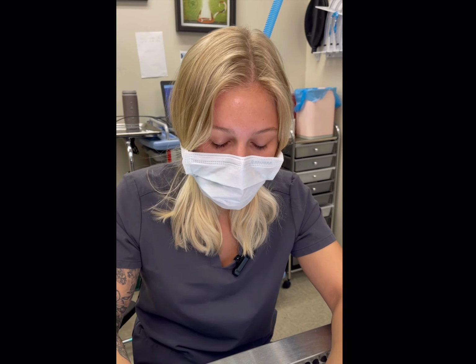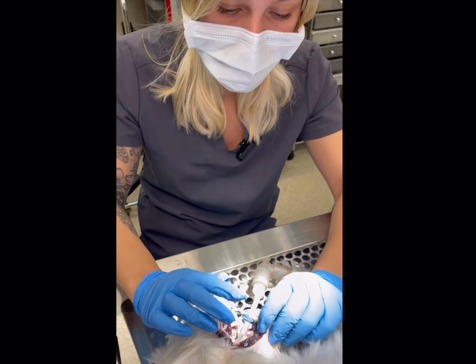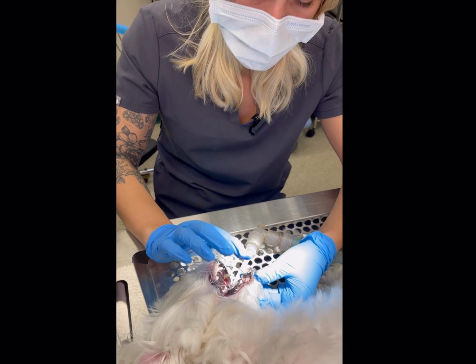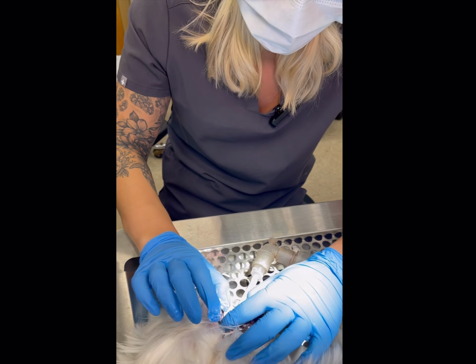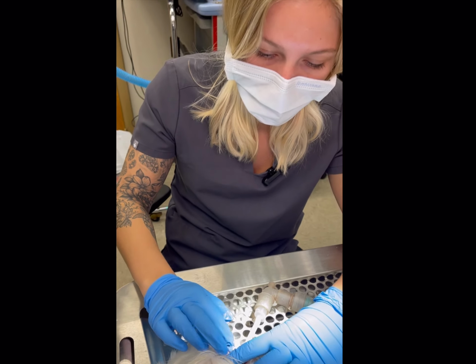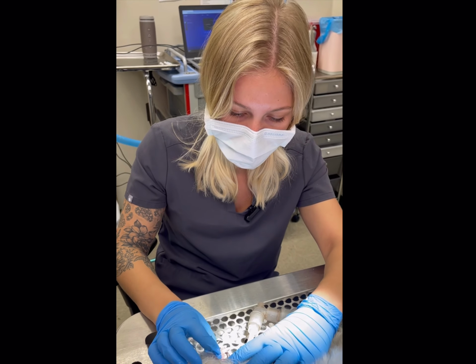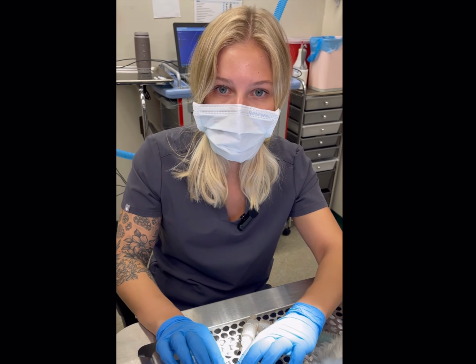Okay, so now that we've scaled all the debris and tartar off of his teeth, we're gonna go in with our polish. The scaler tip that we use can make microscopic grooves in their teeth, so we follow with polish, just to make sure that we have all of those grooves buffed out so that they don't stay there and build up more tartar.